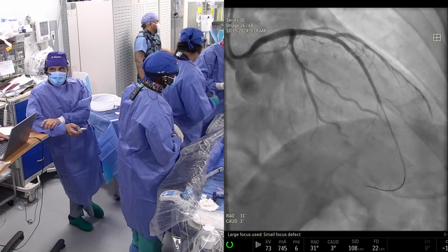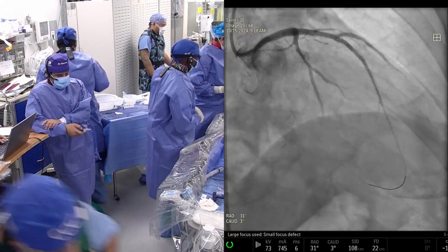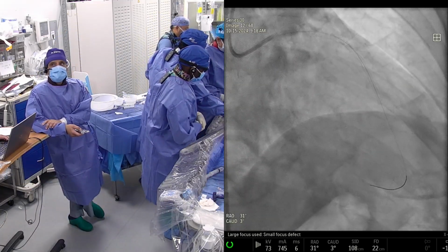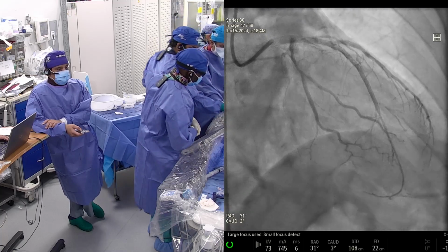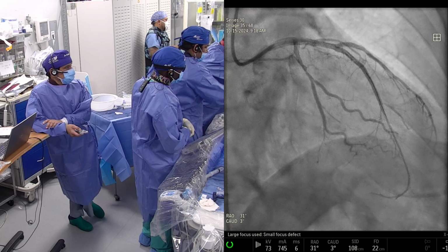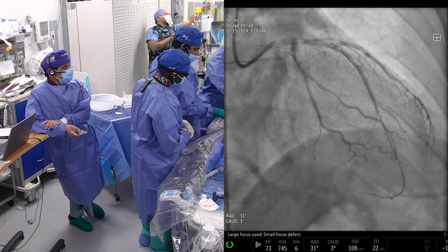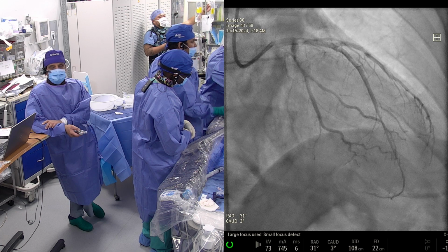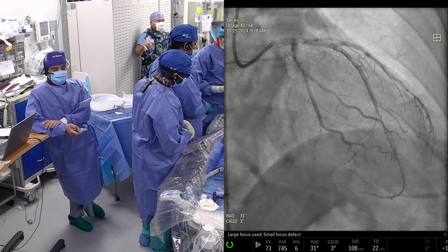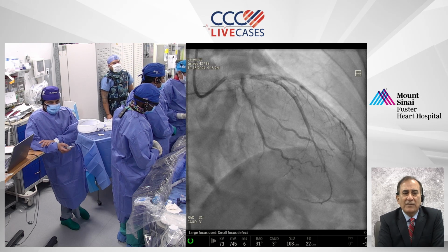Now, Anu, any other questions for us? Any question for AK? Yes, many questions. There are some observations about, again, drug-coated balloons. Is there a little under-expansion of the stents? But I think all of those have been covered. And I want to thank our dedicated viewers. I'm seeing a list of about 15 or 18 of them asking exceptional questions. I want to thank all of them.